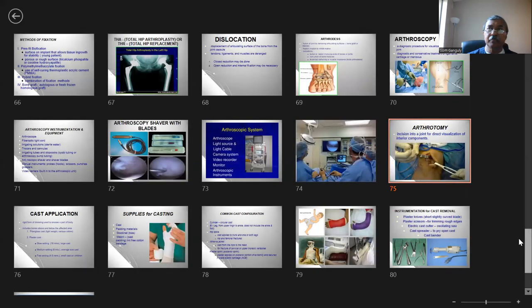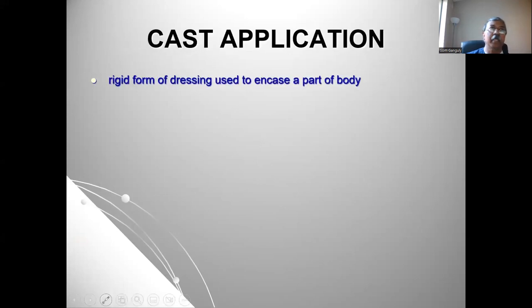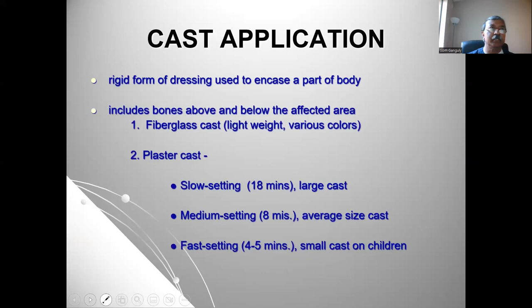Now, after the surgery is done and a joint reduction is done, or a fracture is repaired, either with a closed repair procedure or an open reduction internal fixation process, the surgeon will order cast application. Cast is available in fiberglass material, very light, and you may have many different colors, and also plaster cast, which is the conventional cast material.